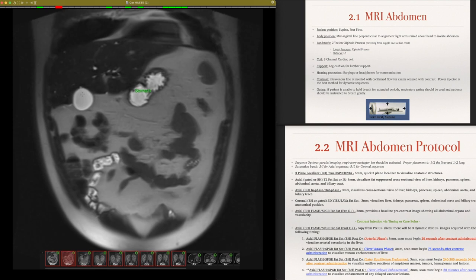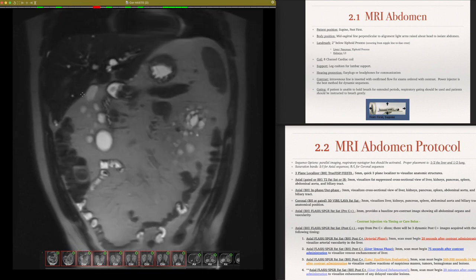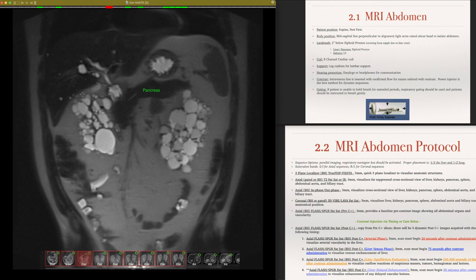This is an NPO patient, so usually for any abdomen study, it's no eating. Withhold your eating for 4 to 6 hours, so your gallbladder is nice and full of bile. Okay. Here's your common bile duct into the hepatic duct.